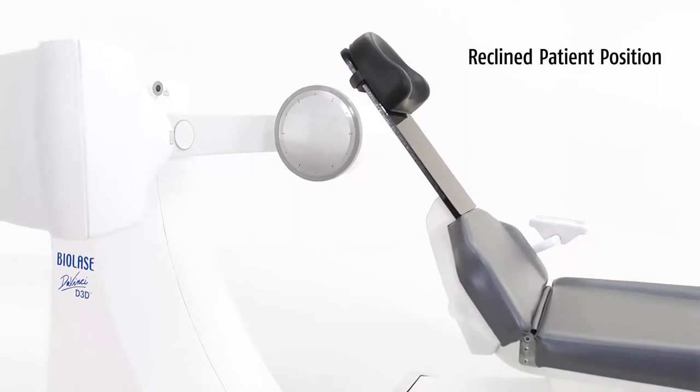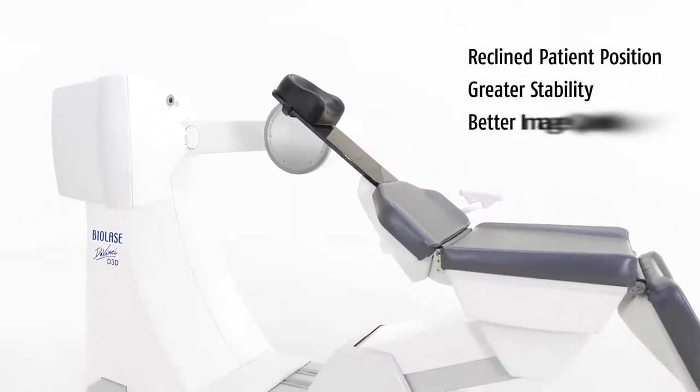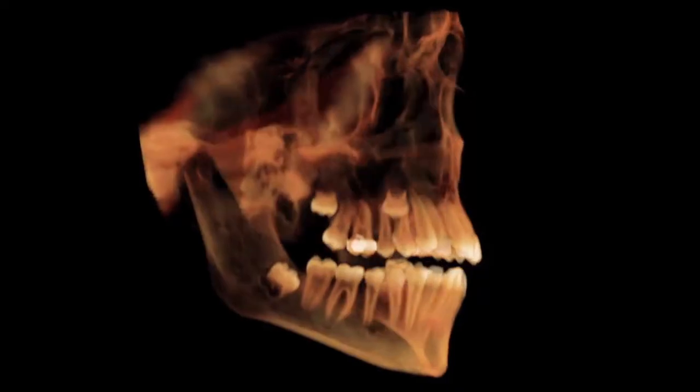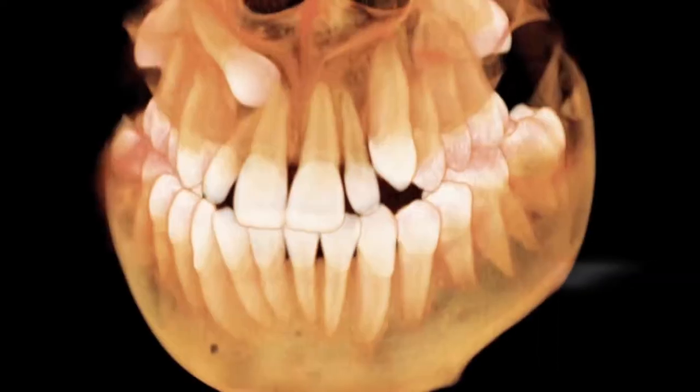The reclined patient position offers more stability than standing or sitting positions, resulting in better image quality and greater patient comfort. The D3D has three fields of view, so you can capture images of the desired area of interest while minimizing patient dose.